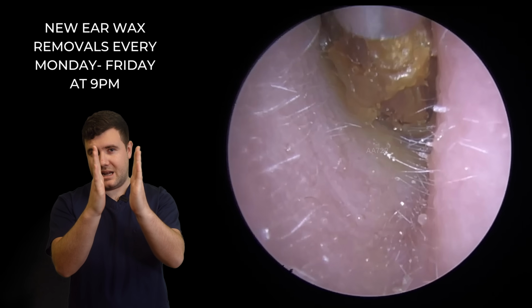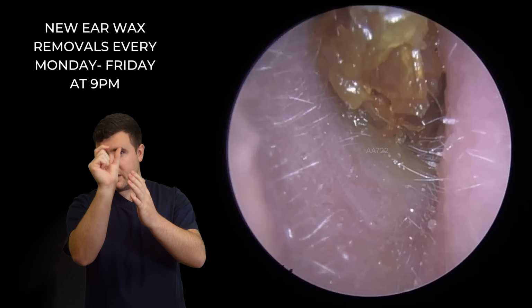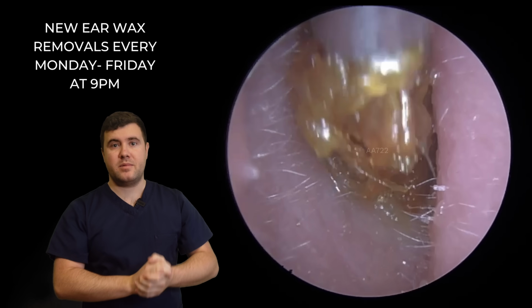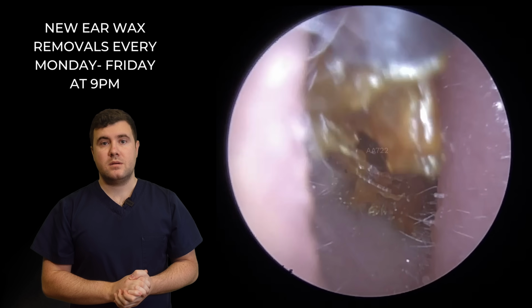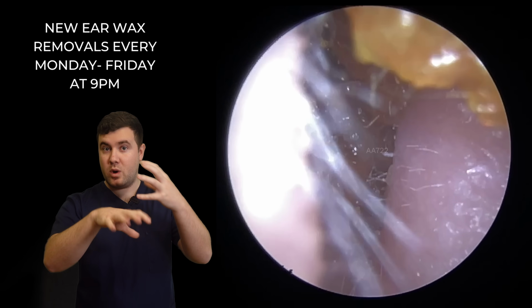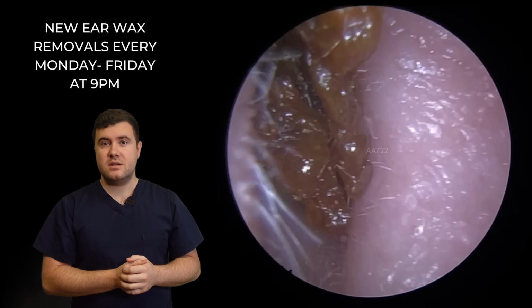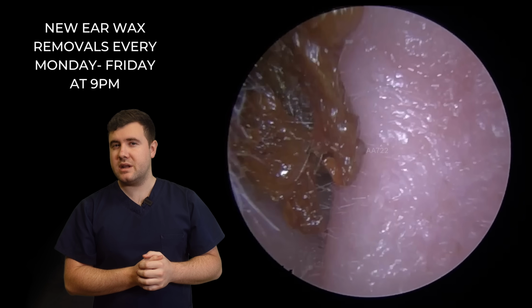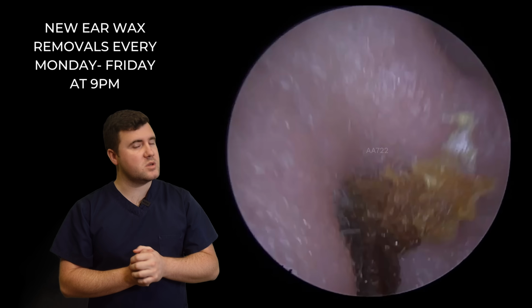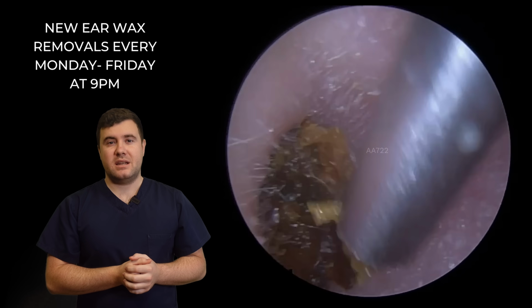So you can see the ear canal is actually quite narrow on this side as well. The standard size Zollner tube is only just about getting into that little gap there. There we go, starting to peel. You can see this one is starting to unravel. So again, a lot of dead skin in this side as well. And we're hoping we're going to get this all out in one go. Nope, it's broken away. So I'll pop them back in with the standard size tube.